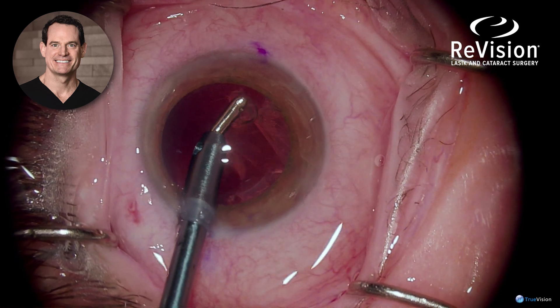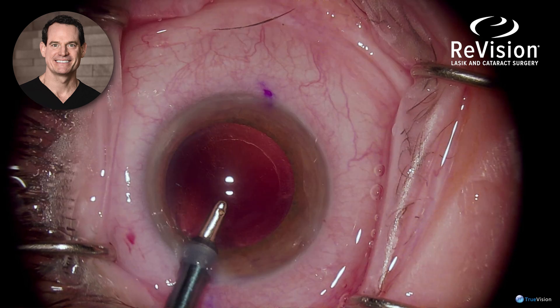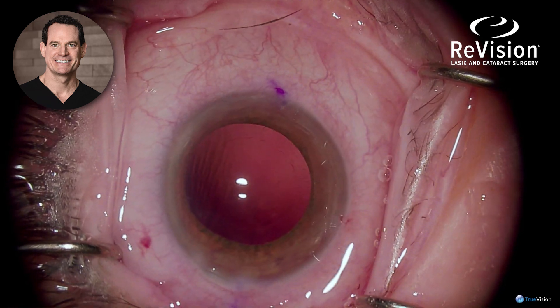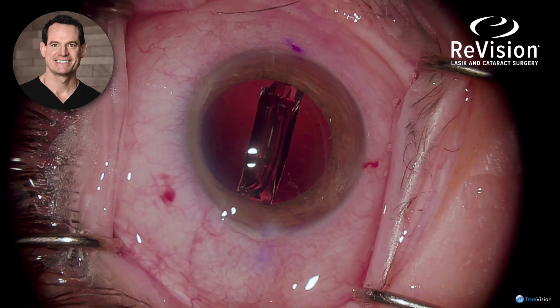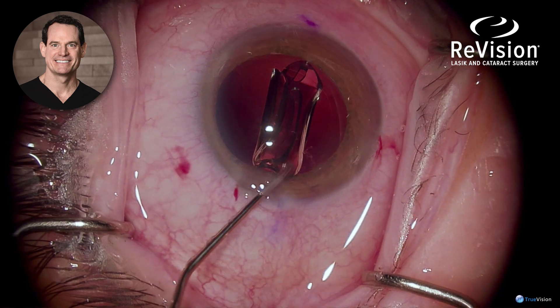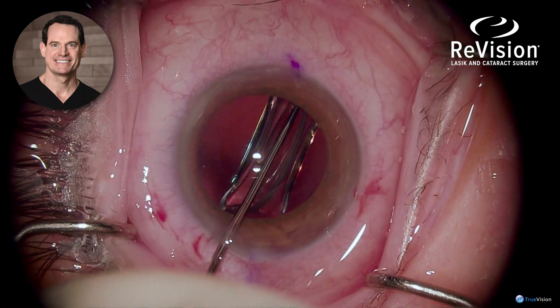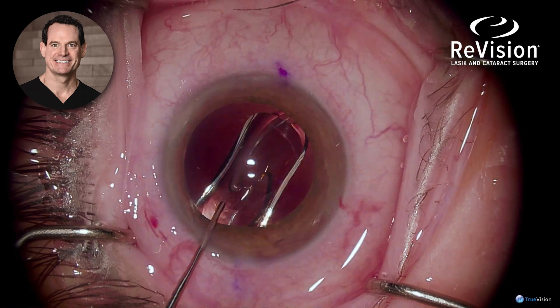Care is always taken for the sub-incisional cortex because it can be sticky and hard to remove. Once the cortex is removed, it's time for the intraocular lens to be inserted, using a Lester hook to push the intraocular lens into the capsular bag and to release the haptics that tend to stick to the optic.